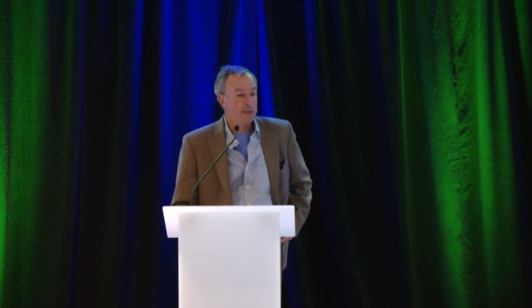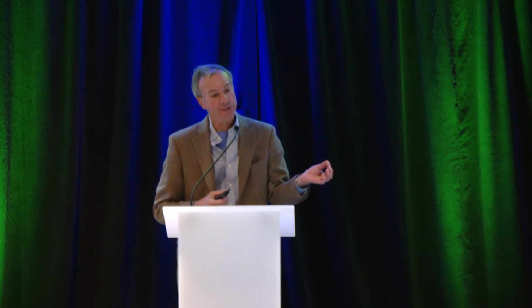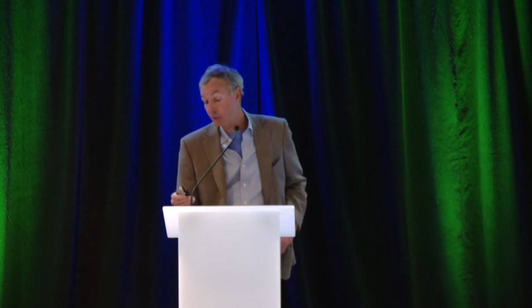And you'll notice that there was a typo in that publication, which I discovered 19 years later. But anyway, what a sleeve device did was it would record the highest pressure along a length. And that's what you see on the right there. Whereas if you pull a catheter across, it hits the sweet spot and then it comes down again. You pull a sleeve across and it records the highest pressure in the sphincter for the entire length of the sleeve. So it was a way around sphincter movement.